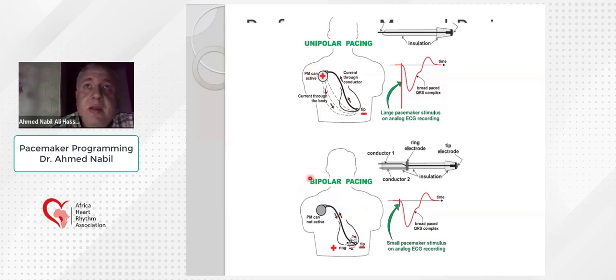Unipolar has some drawbacks, such as more electromagnetic interference and less consistency. Usually the bipolar is preferred by nearly all physicians, but unipolar pacing sometimes has better values.